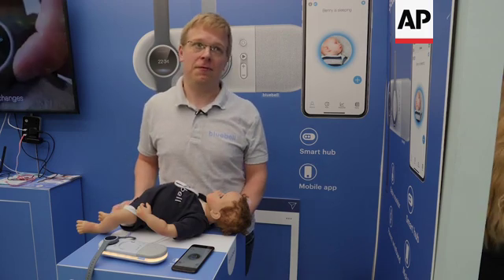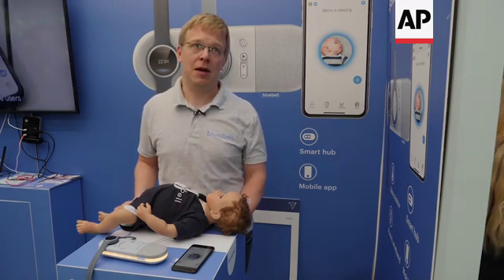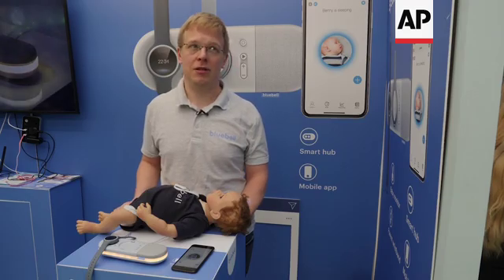Obviously we're also warned if something happens to the baby. So if your baby has a respiratory infection for example, we can help with the breathing rate and temperature. If your baby starts rolling on their tummy and you're worried about that, we will get alerted about those things as well.